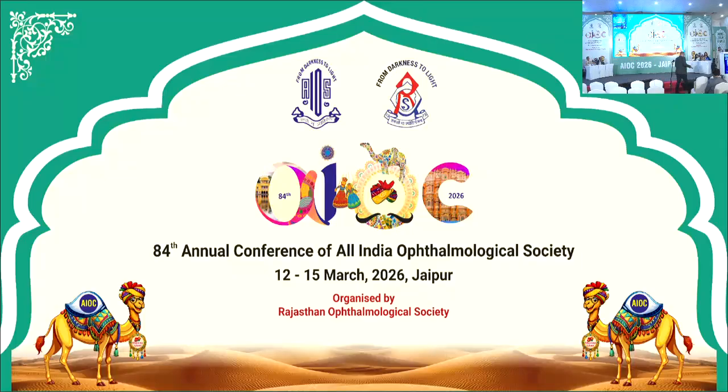It is easy, sir, but the hub of the cystitome, the edge, can touch the endothelium if the chamber is very shallow.